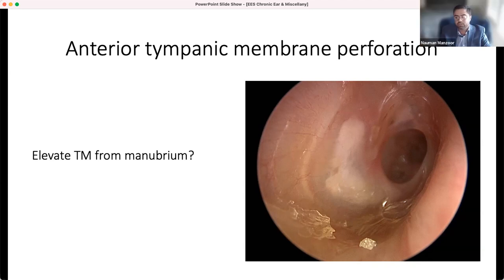Yes. So I think once you are elevating posteriorly, if you incise and get on that subperiosteal plane on the malleus, then you can still keep the superior drum attached to the lateral process of malleus. You don't have to remove it in this case because your perforation doesn't reach that up high. But if you have a larger anterior perforation going much more superiorly, the first principle would be to make sure your graft is covering the entire perforation by a good margin, because you would hate to see this patient 3 months after surgery and there's a 10% superior anterior perforation because your graft was short.